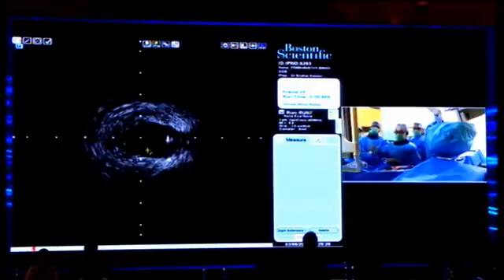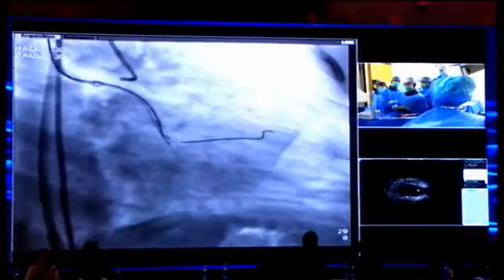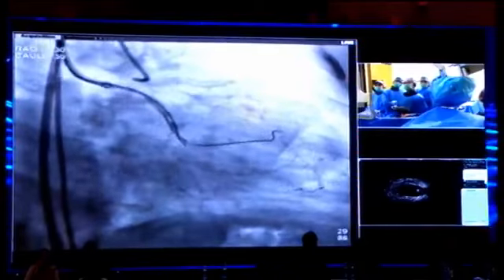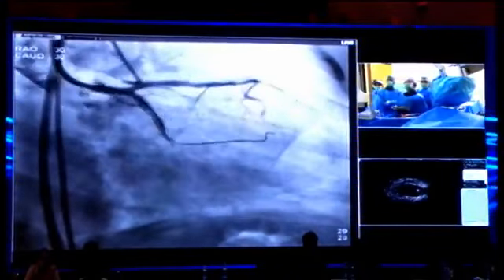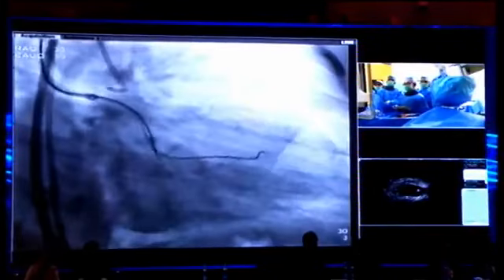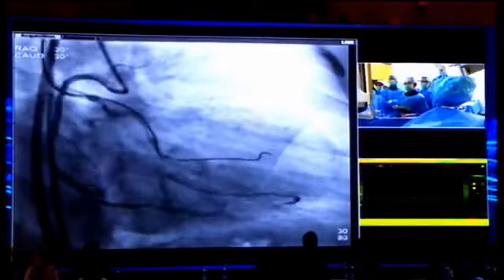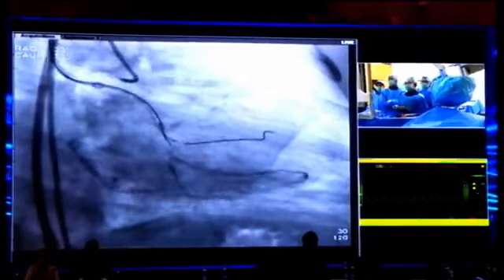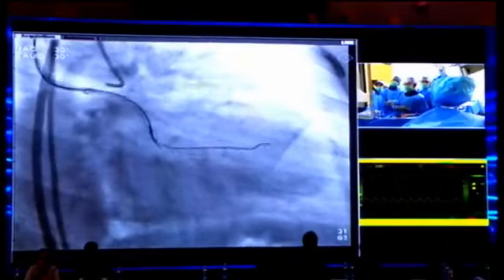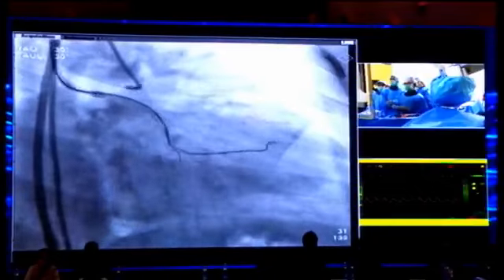Okay, please switch to the angio. Angio. Okay, thank you. I will remote with you. Yes, and after that, I immediately checked the angio from antegrade. This image is the same as the IVUS marking before insertion into the CTO region. And after that, I checked the contralateral injection, which is not so bad from this other corner view. And continuously, I advanced this Gaia second wire. My hand feeling is not so bad, and I feel a little bit of resistance as I advance the guide wire.